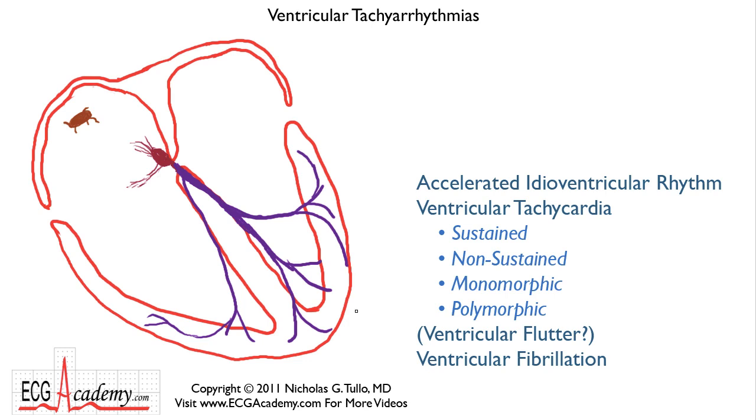Hi, this is Dr. Nick, and this is the last section in the basic course on ECG interpretation. I'm going to talk about ventricular tachyarrhythmias.